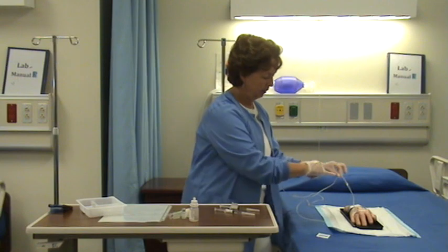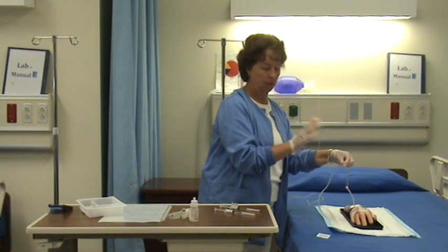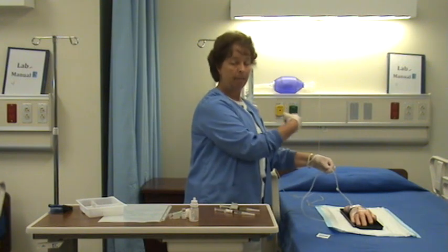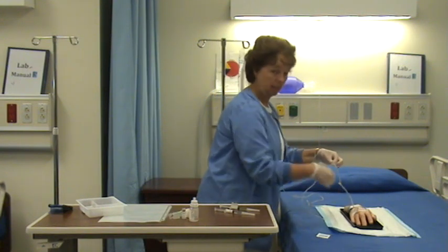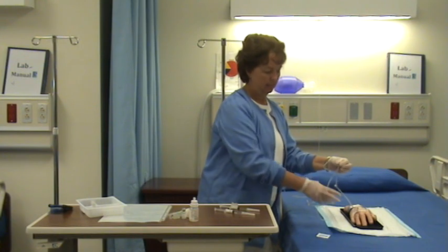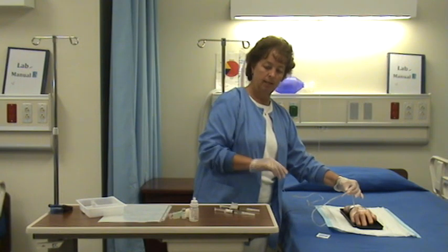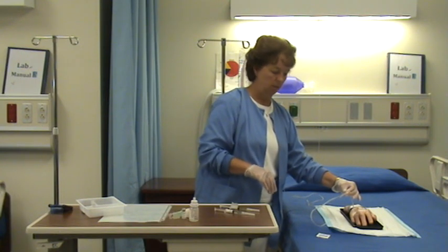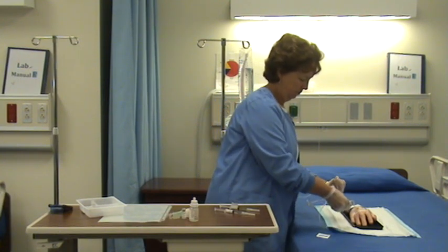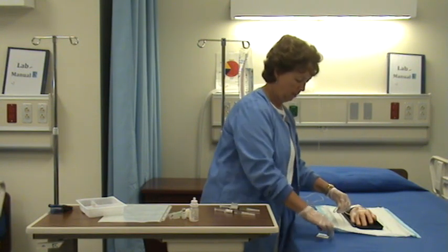Now, because I'm going to give it at this port, what I want to do is crimp off the IV tubing above it to make sure it's probably not going to backflow, but to make sure that you're just injecting into this area, I'm going to crimp that off. And the way I like to do it is make a circle, so then you can hold the whole tubing in one hand and you have the other hand free to give the medication. And then I've got my watch ready to go.